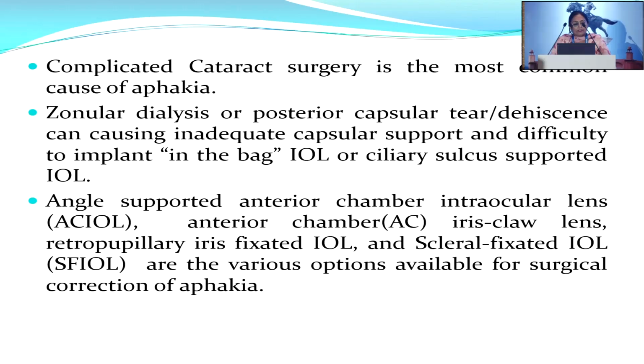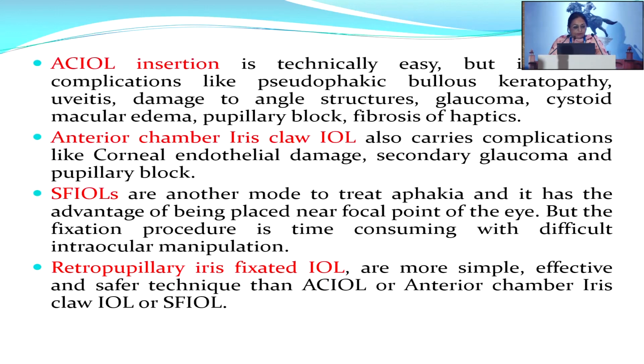Zonular dialysis and posterior capsular tear and dehiscence can cause inadequate capsular support and difficulty implanting the in-bag IOL and ciliary sulcus supported IOLs. Angle supported anterior chamber intraocular lenses, iris claw lenses, retrofixated IOLs and sclerofixated IOLs: there are various options available for the surgical correction of aphakia.